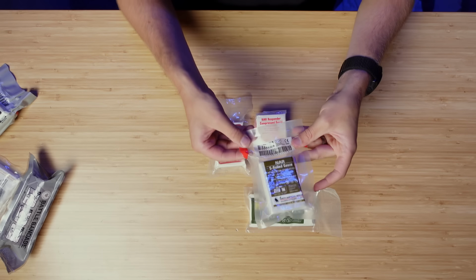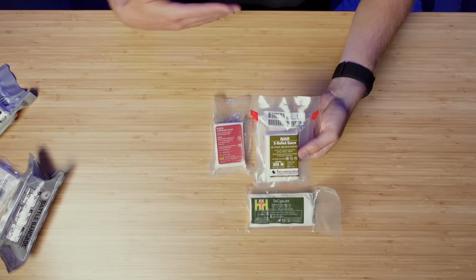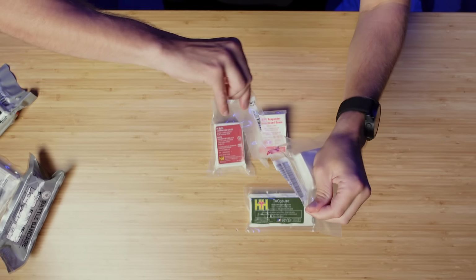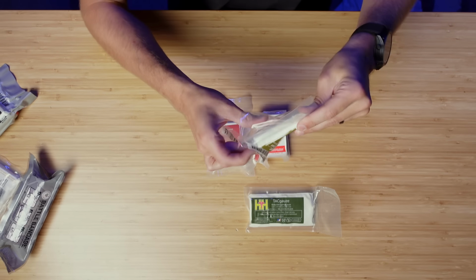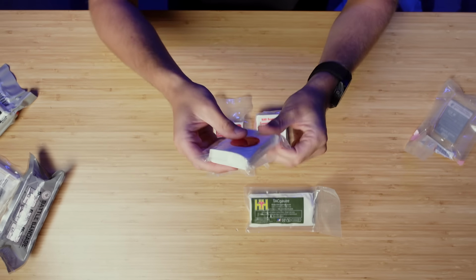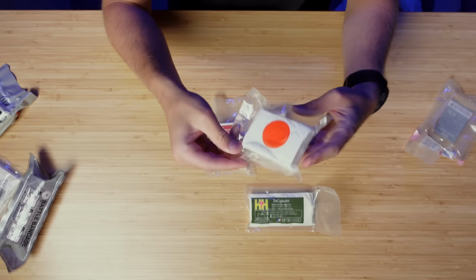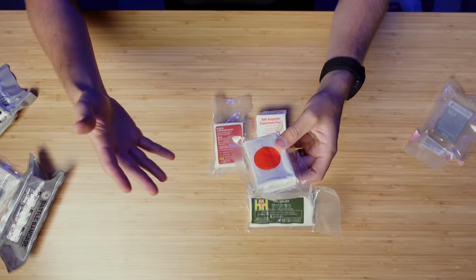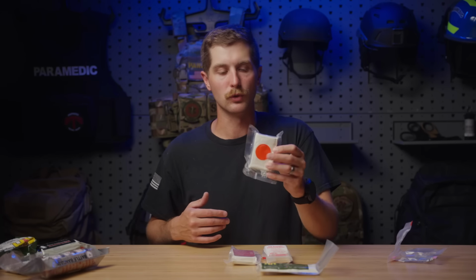So with North American Rescue, anything that's red is going to open or move in some way. So here, I can take this guy, I can peel it up, and I can remove the gauze, but wait, there's another package inside of it. Now, this is kind of a slick packaging deal. It's there for a reason, but it can be very confusing. I short-circuited on a video a couple years ago when I opened one of these and didn't realize this was going to be a case.